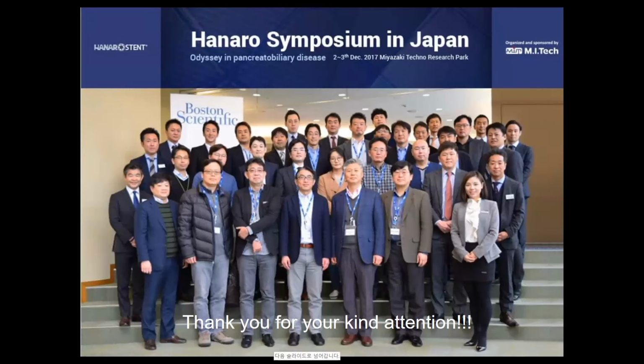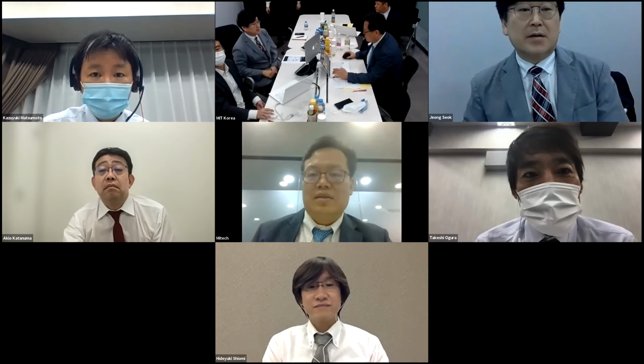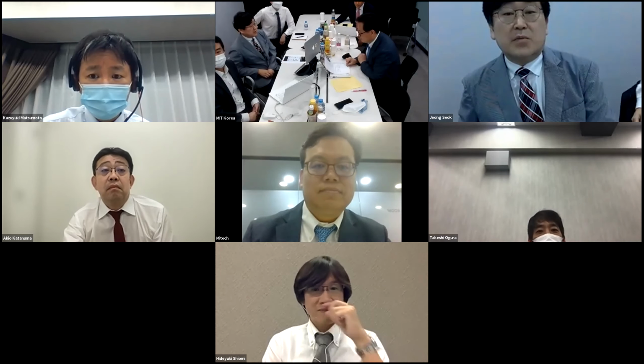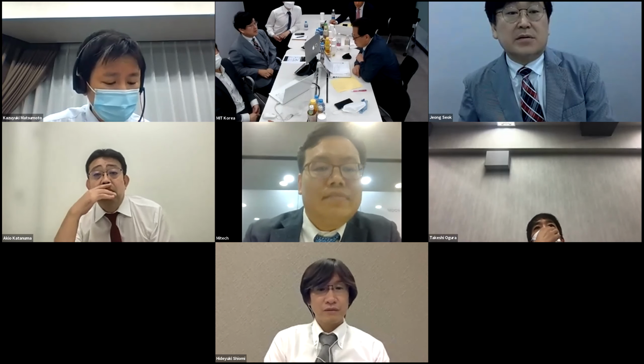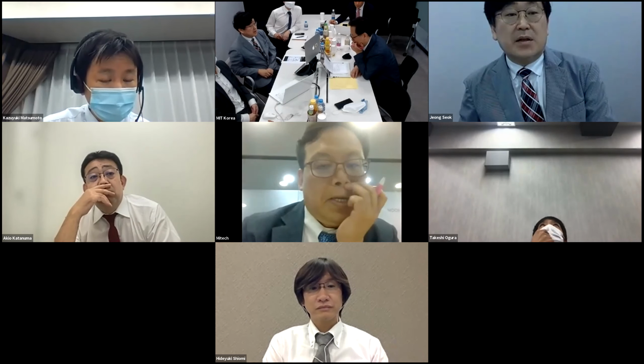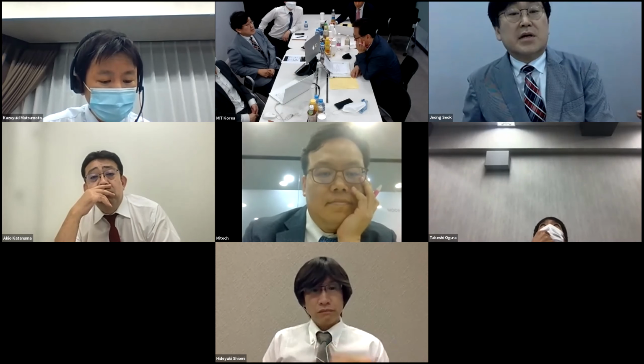Thank you for a very nice presentation and interesting, informative lecture. Dr. Kwon, I'd like to ask a couple of questions. In malignant hilar biliary stricture patients who underwent chemotherapy after inserting a plastic stent, the patency of the plastic stent seems to be less than 1 month. Which type and diameter of stent do you use?